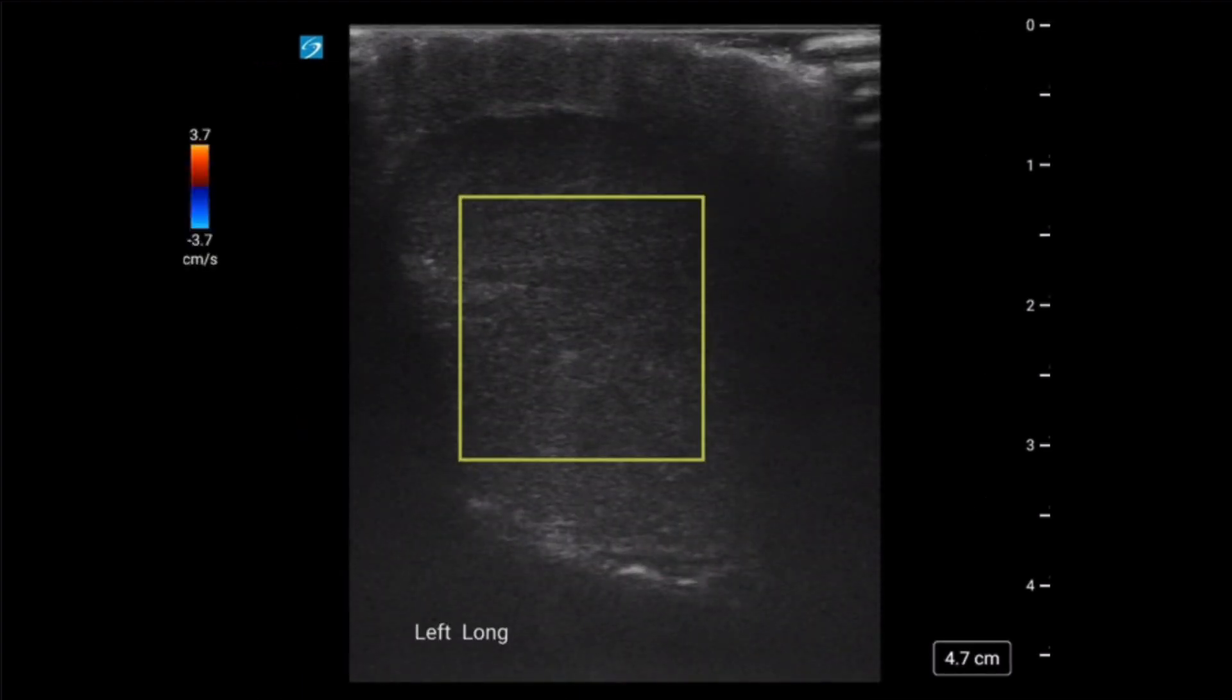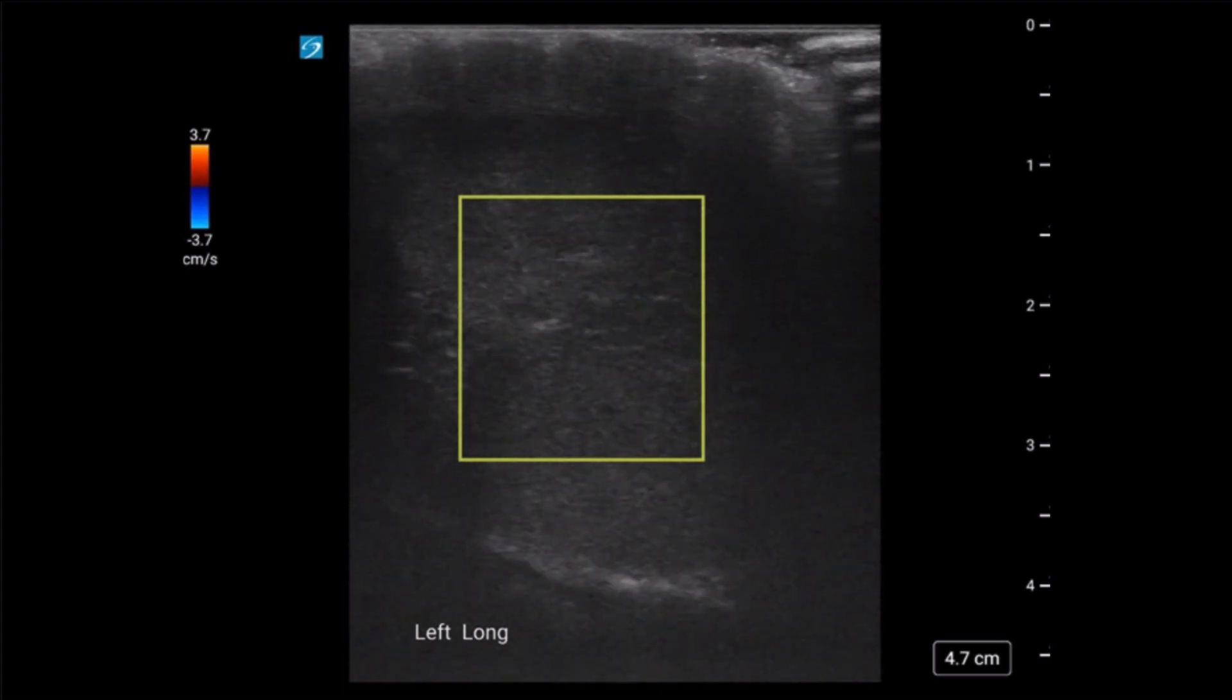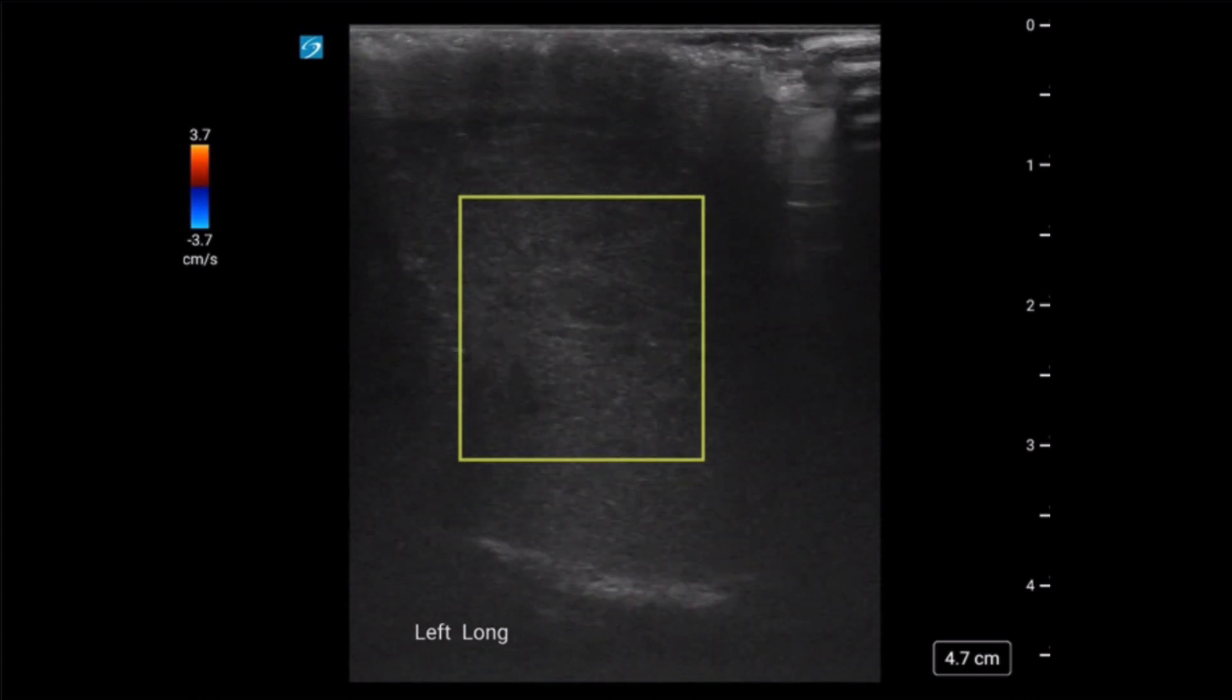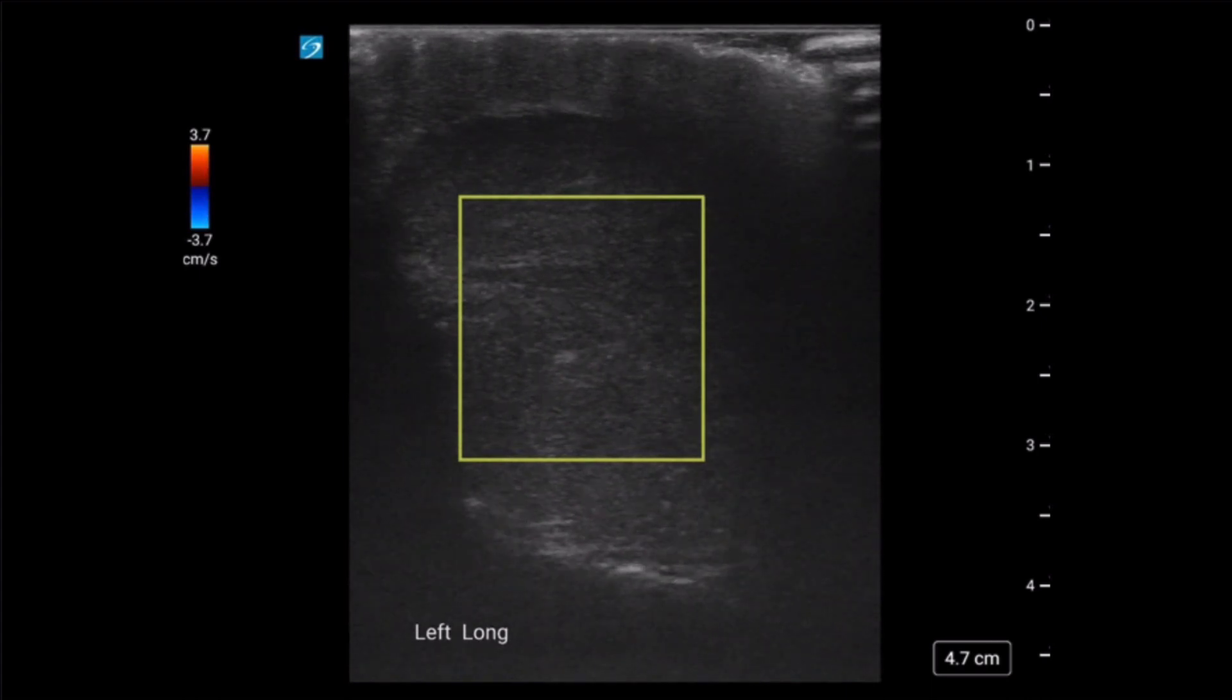Given the concern for torsion, the operators utilize color flow to image the symptomatic testicle in more detail. As many of you are aware, the color displayed only represents directionality, flow towards or away from the probe. Red and blue do not differentiate venous from arterial flow.